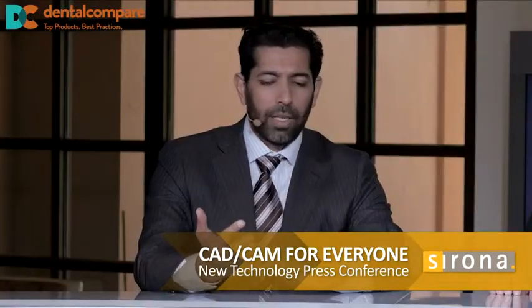And with regards to material choices now, any of those restorations can be done out of lithium disilicate, Emax, full contour zirconia. There's some new reinforced materials that are coming out that are going to give the average practitioner a lot of range of choices with regards to the materials that they can use. Absolutely, and some higher strength ones to come too, which is going to bring a lot more dentists into the fold who really want some strong materials.